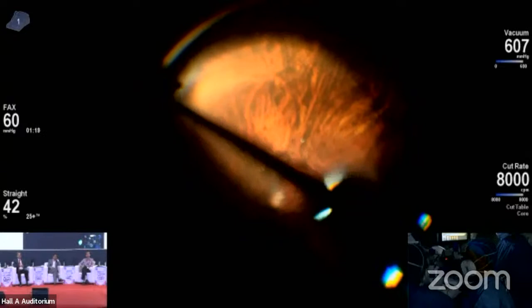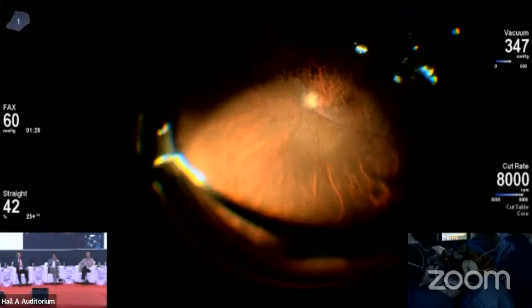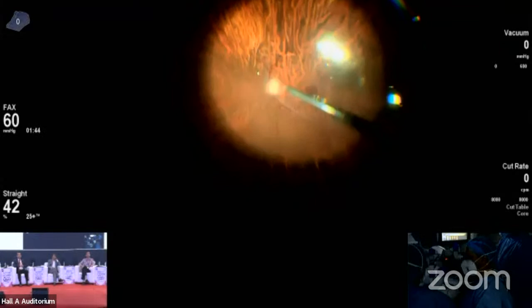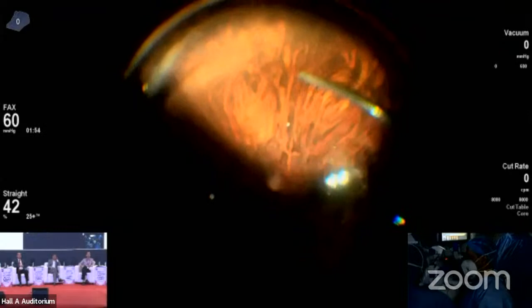So temporal and nasal periphery may be a little bit difficult to see with the help of MIVS because the ports open inside the vitreous cavity and there may be shadowing. So one has to adjust the light pipe a little bit to see the periphery on the temporal and nasal side. So if you see, we have already completed our vitrectomy. We have done the peripheral shave. And this is the tear. You can see it's nicely settled. And this is our retinotomy. So we'll proceed on to our next step, that is the laser photocoagulation.